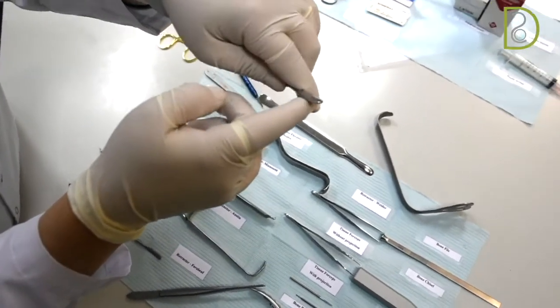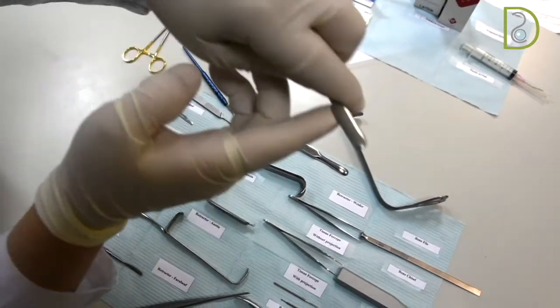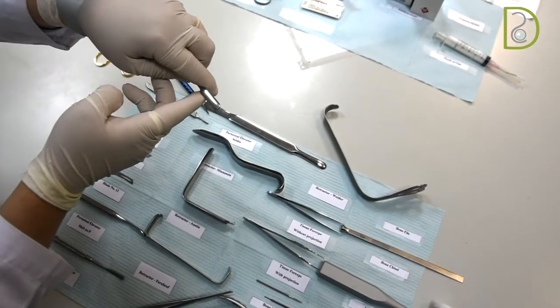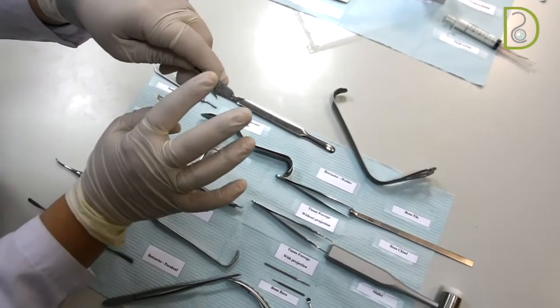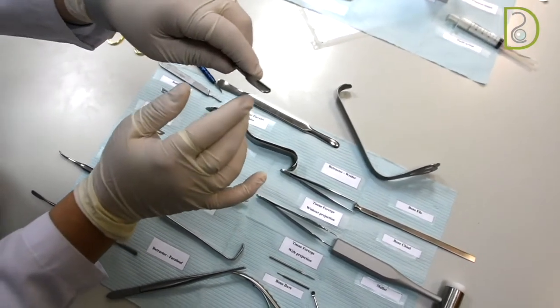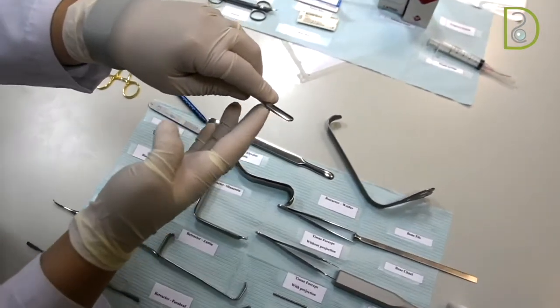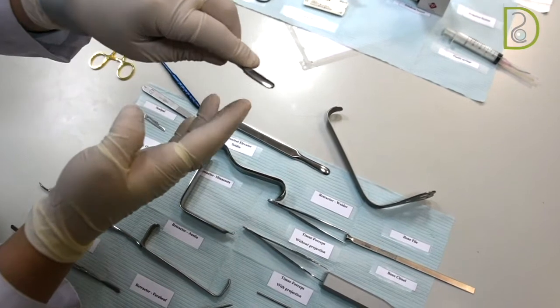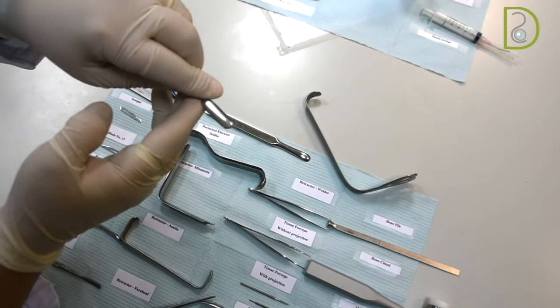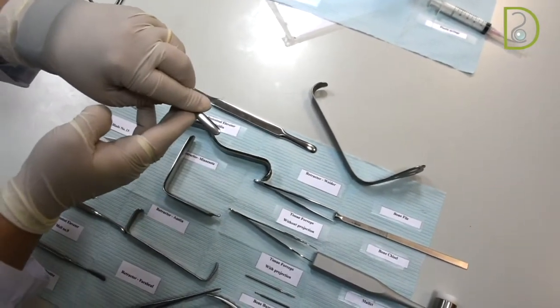That means when you want to use it, you will just rub the surface in one direction and then pull up and then come down again and rub the bone again. This way, you will only smooth the bone. Here, it doesn't serve the purpose of cutting the bone, but rather smoothing it. So these are like sharp teeth in one direction, and their manner of action is only a pulling action, not a push and pull.